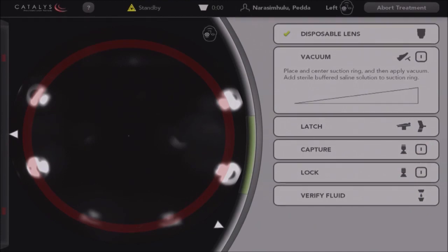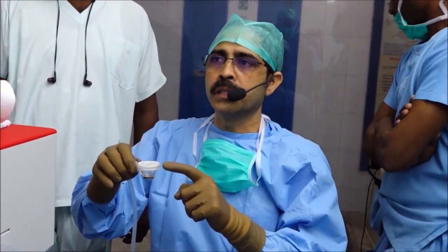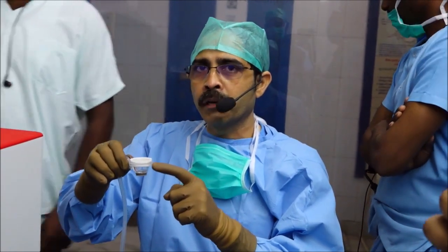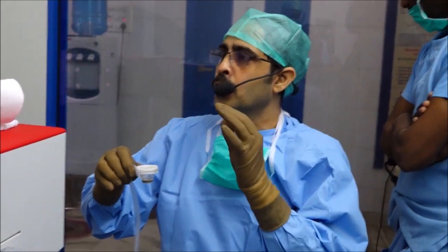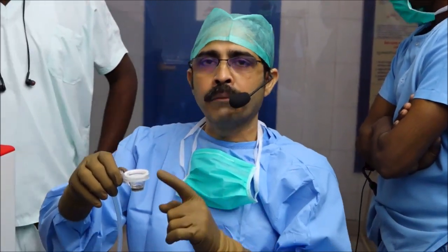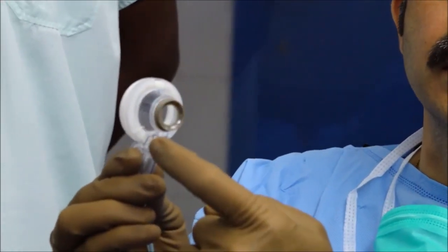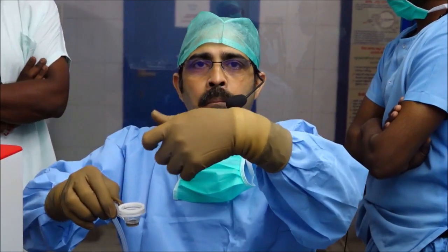Now I am starting the procedure. I want to show the liquid optic interface — LOI. Compared to all other laser machines, the liquid optic interface has many advantages. Most systems have to indent the cornea to get an OCT, which creates Descemet folds and may give erroneous results. This is a liquid optic interface — called LOI — which is a disposable and very expensive component; that is why these surgeries are costly. Its advantage is it does not touch the cornea at all. The rim — 12 mm or 14 mm diameter inside — catches the scleral perilimbal area without indenting the cornea, and keeps balanced salt solution inside the interface.